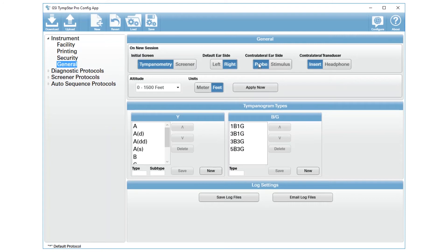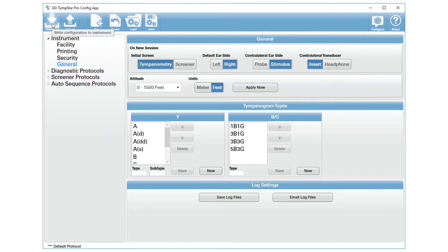It is default to Probe, but you can simply change it to Stimulus, and then your GSI TimStar Pro will report your contra reflexes from the stimulus side. To activate these settings, you will press Download to put those settings into the TimStar.